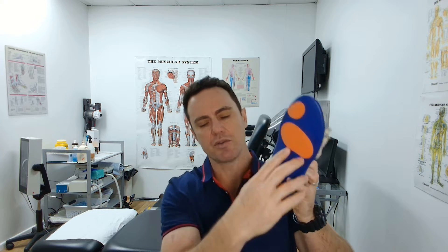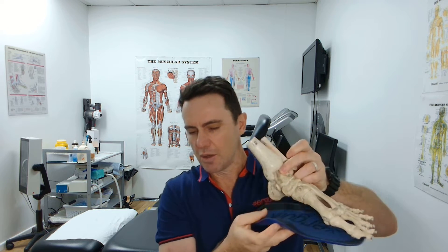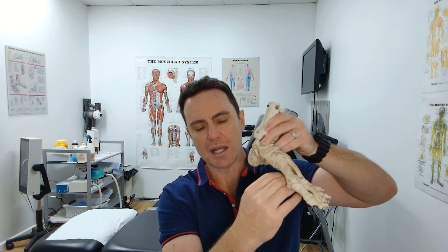So what do we do to either prevent plantar fat pad atrophy or treat it? Prevention is obviously better than trying to fix it after the fact. If we use a soft arch-supportive orthotic insole with cushioning positioned in the right areas of highest pressure, and support the arch so there are no areas of really high pressure at the forefoot or heel but load is spread through the arch, this can help to reduce the degradation of the plantar fat pad.